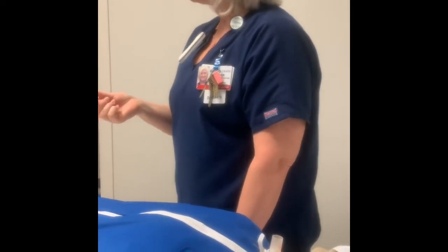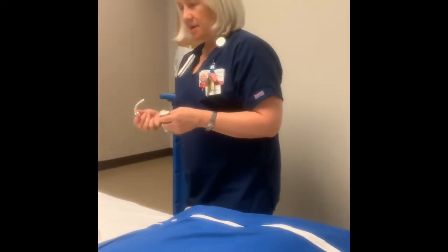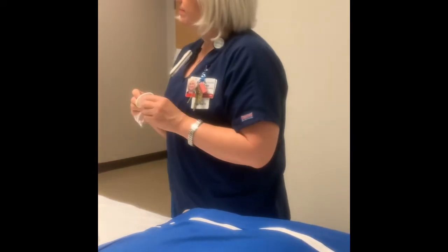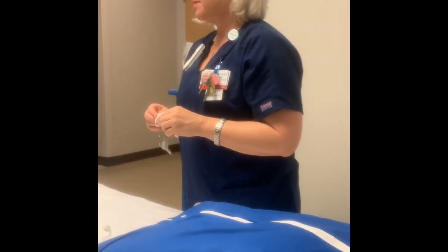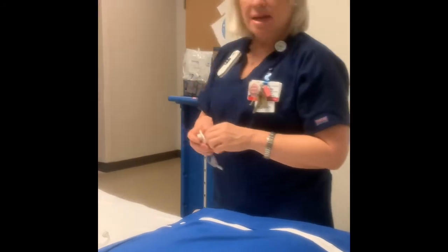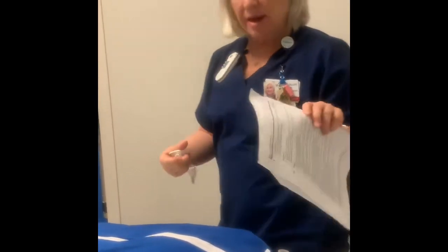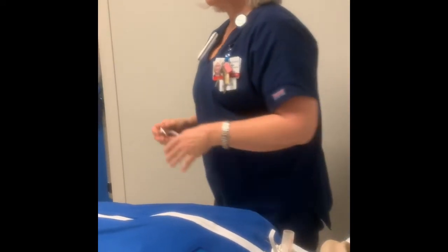So if the patient is a fresh trach, are they supposed to have their obturator with them? Yes. And various sizes too, I guess. I remember this came up when Erica put that box together. And it was told to us then that the only people that could replace a trach was the physician. No, if you're a validated nurse. If you read your policy here at Gateway, the Banner system policy, it drills down to Gateway: nurses can do it, but they have to be validated.